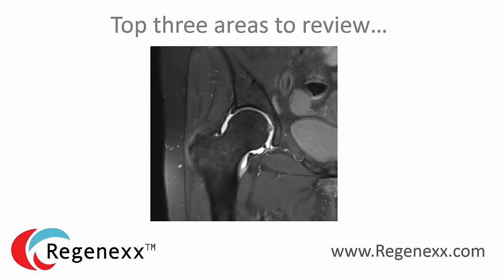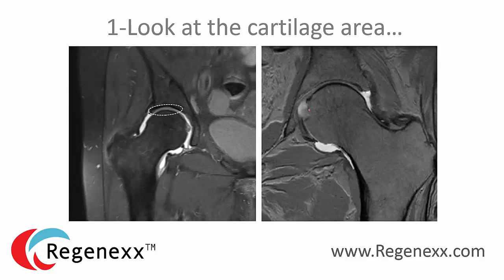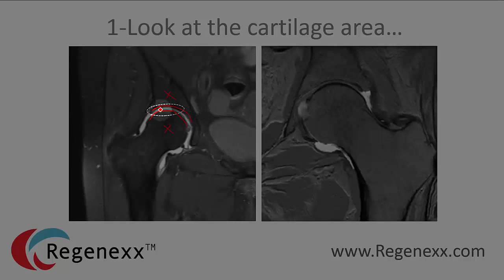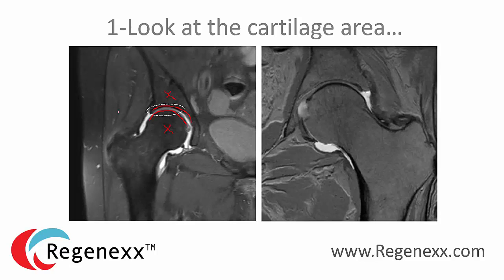Let's go over the top three areas to review. Number one: look at the cartilage area. You can see in this image that you've got dark bone here and dark bone here, and then you've got the ball in its socket. The gray stuff between my two red lines is the cartilage — you should have gray stuff in there. If you don't have much cartilage, that's arthritis.